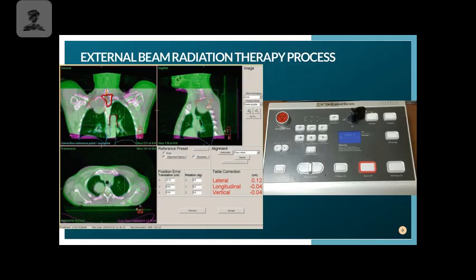We can use that. We can look at the arm positioning, and you can actually see how the pink and the green and the white that's underneath of the bone don't all overlap. That means that the patient's left arm is in a different position than the very first day that we imaged. Over here, they overlap fairly well. They're still not perfect, but that's okay. Our tumor actually is right here that we're trying to image and overlap.